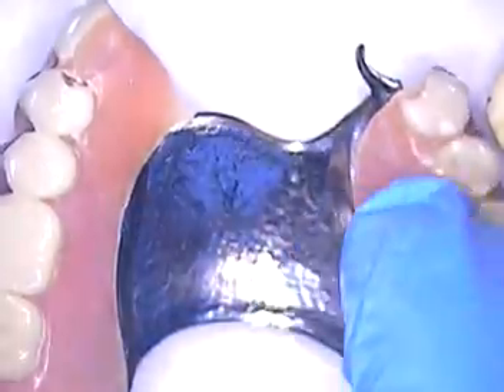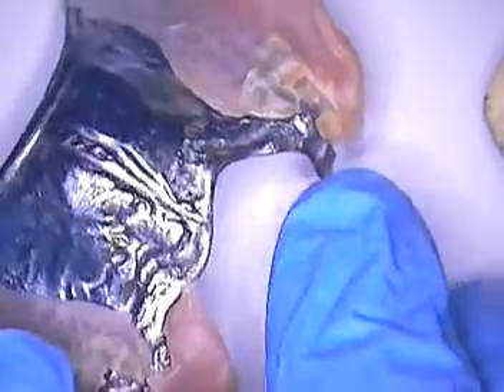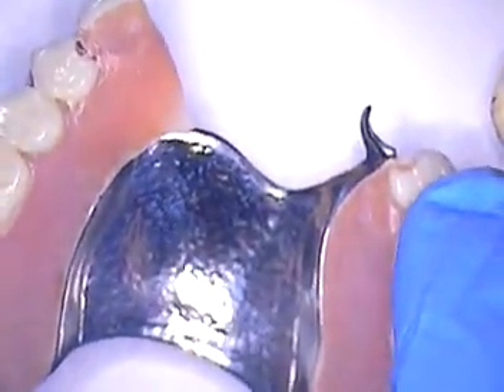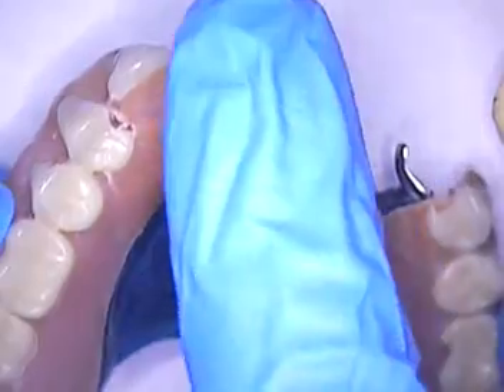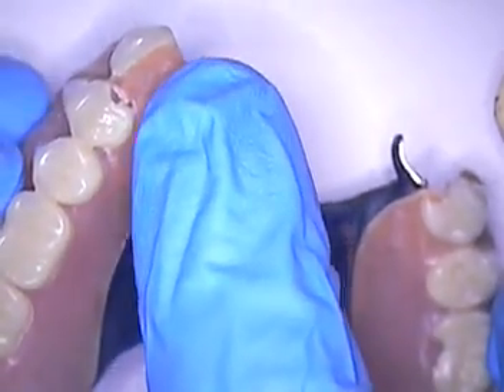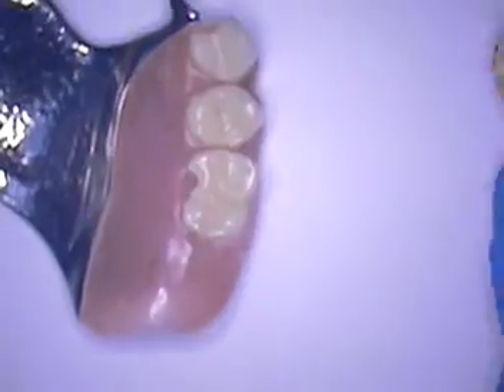It's a maxillary palatal strap. It did have a couple of precision attachments; over the years things fractured and displaced, and the partial became very loose. He lost number six, which was replaced with an implant — a very large diameter implant.